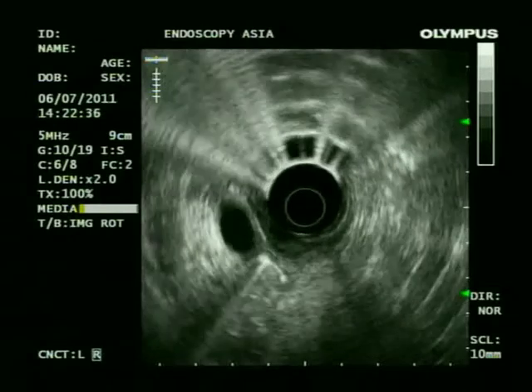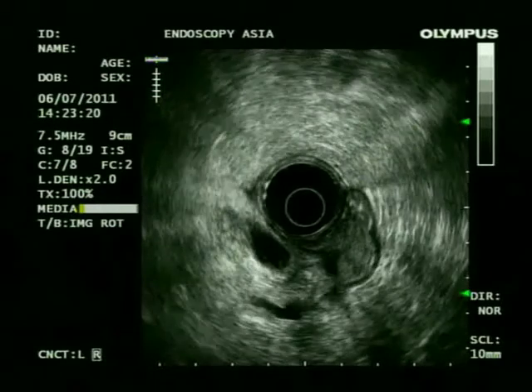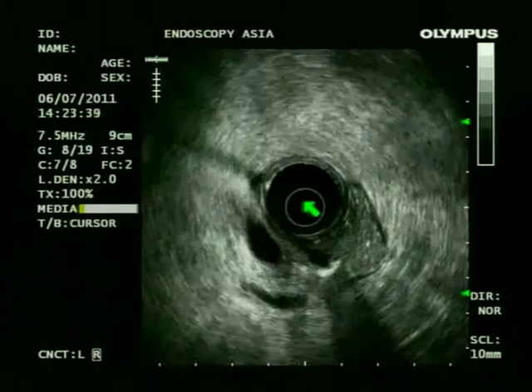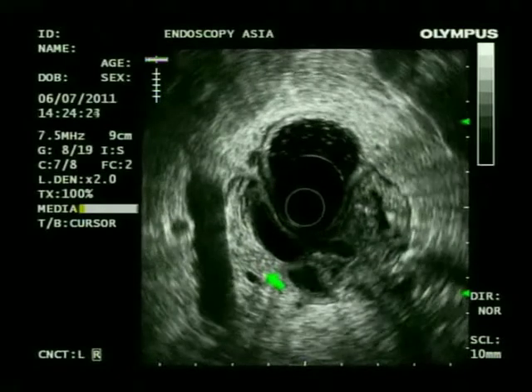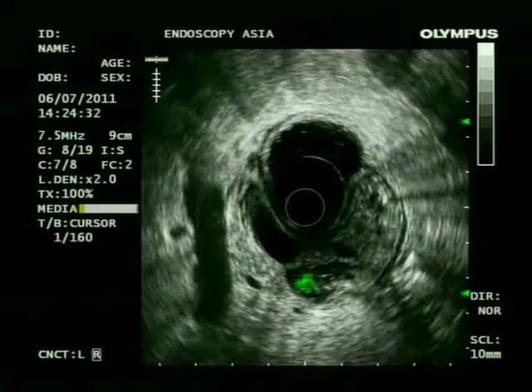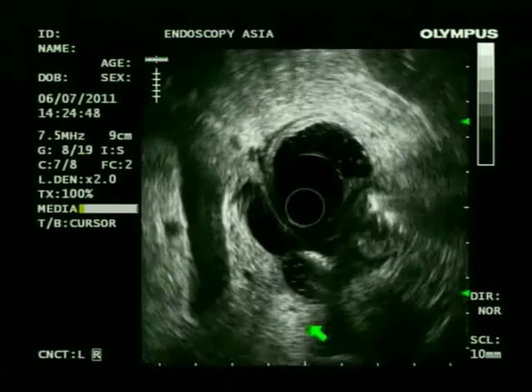A careful evaluation of lower CBD was first carried out, and we can see some hyperechoic, echogenic artifacts at the lower end of the CBD and the MPD. This could be a diverticulum, duodenal diverticulum, either an intradiverticular ampulla or a periampullary diverticulum.